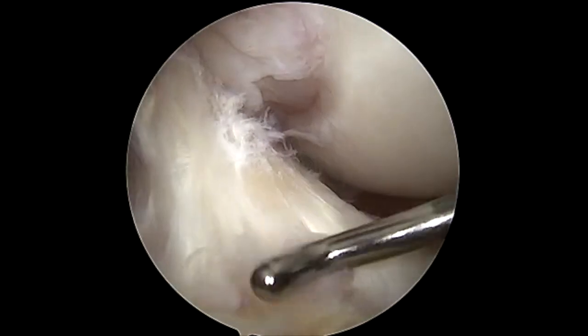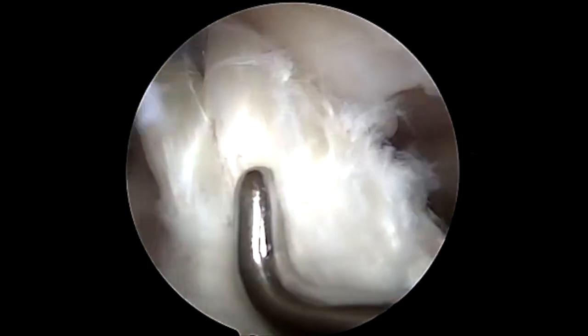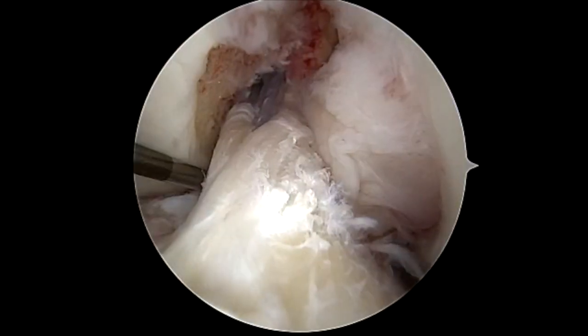Final view of the repaired ACL and examination of its tension with an arthroscopic probe is seen from the anterolateral and anteromedial portals, respectively.